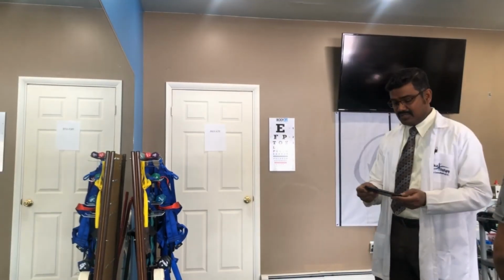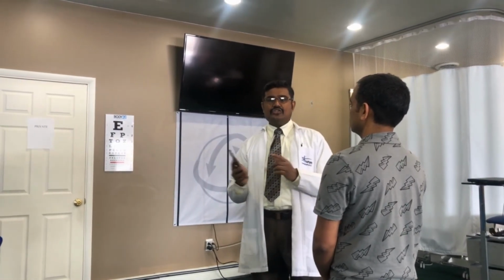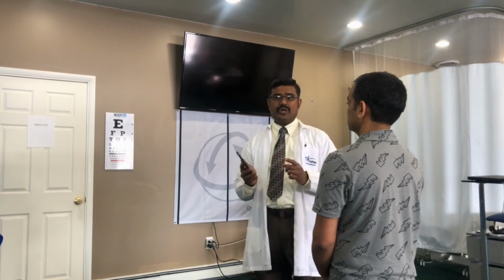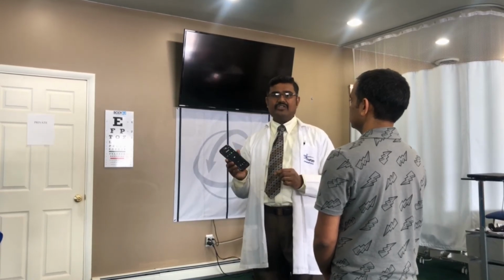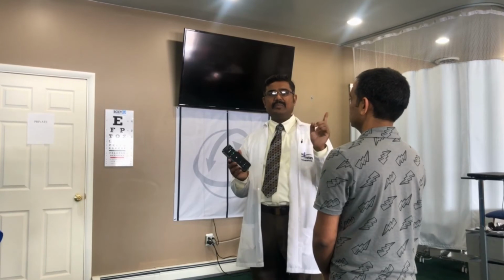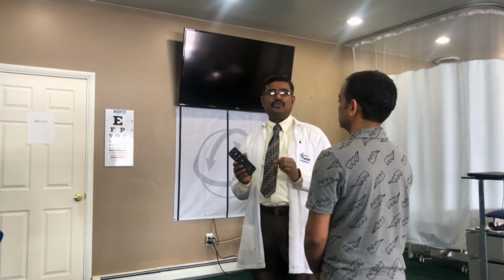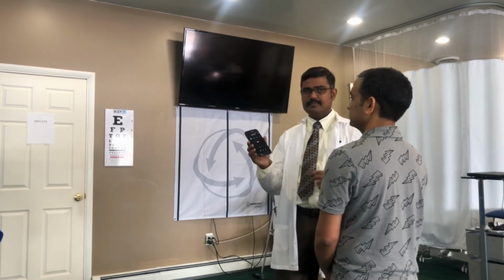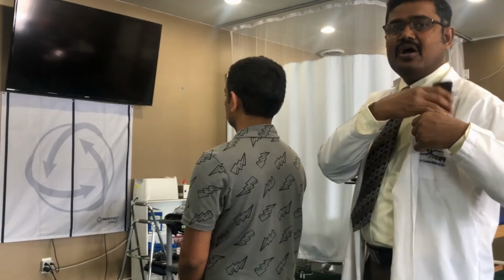In order to do this, the test is recommended using a metronome. The head should be moved at 2 hertz, that means two rounds in 1 second. So we set up the metronome at 240. When the beat is happening, he's going to move his head side to side, 2 rounds in 1 second.